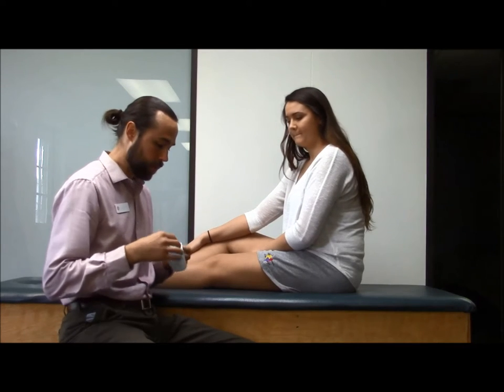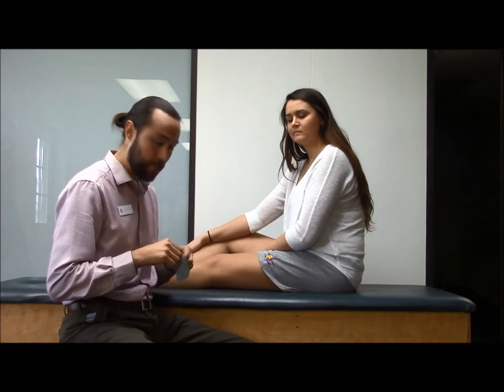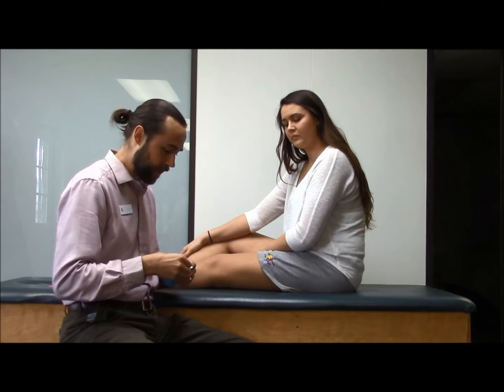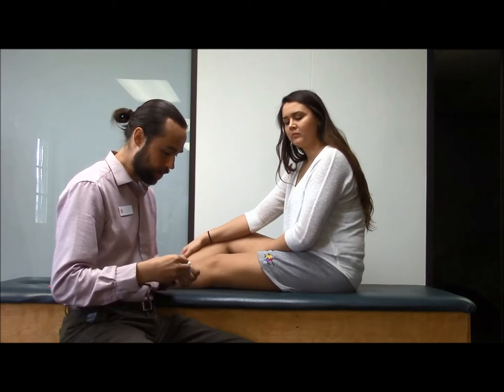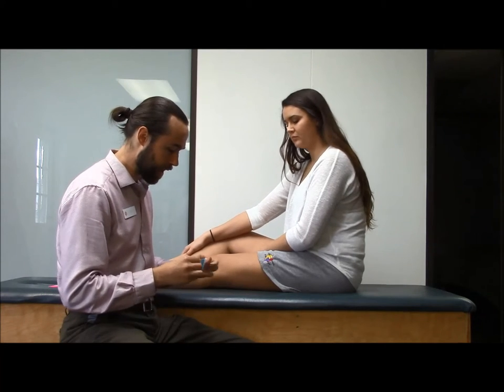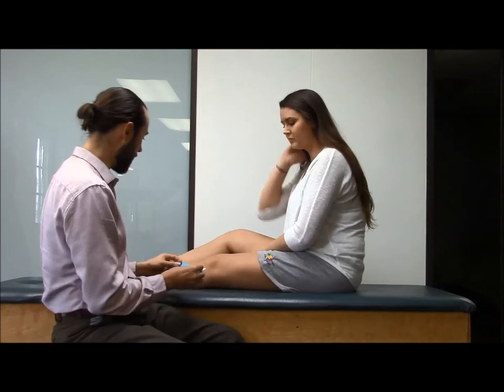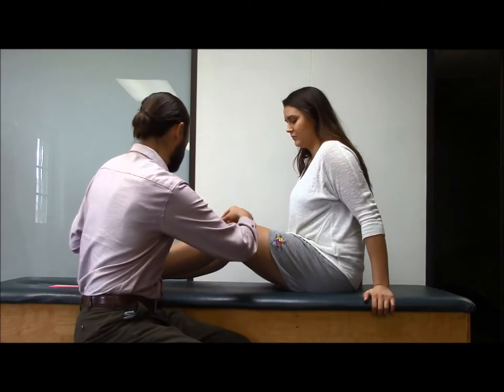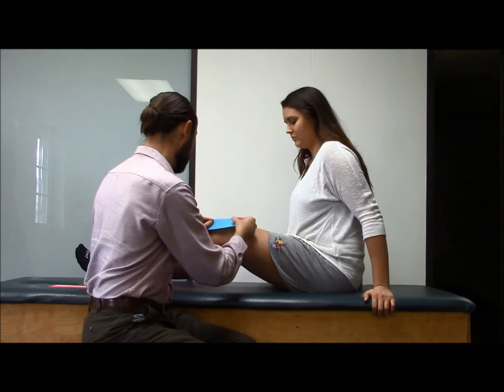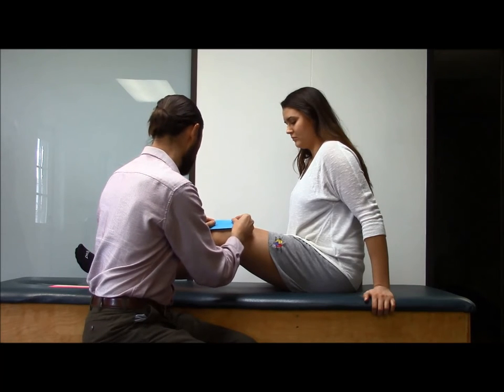The first one is to support her kneecap. With the kneecap when it's unstable, primarily it tends to track to the outside of the knee. So I'm going to use a little strip of K-Tape here to help her kneecap track more towards the inside. I'll have her start with her knee bent a little bit, and then I'm going to find her kneecap here and give it kind of a horseshoe tape.